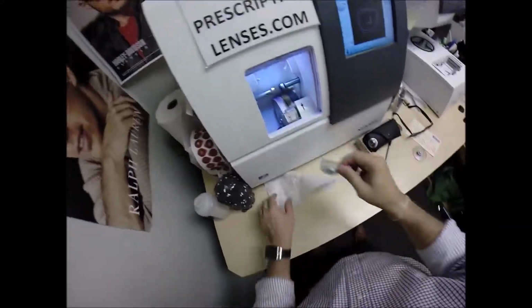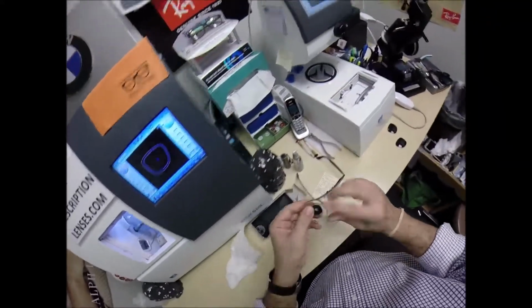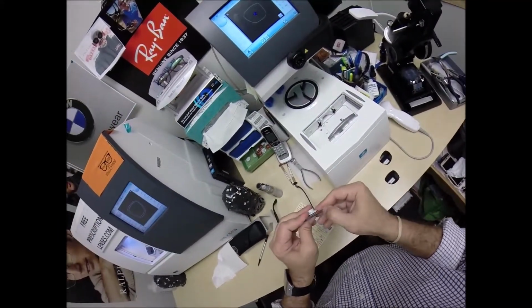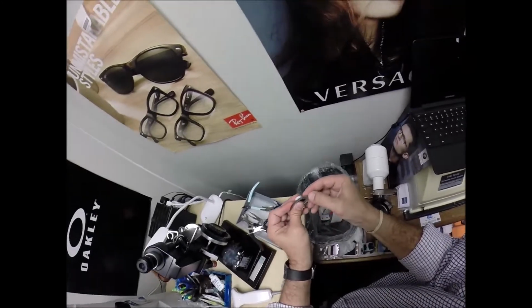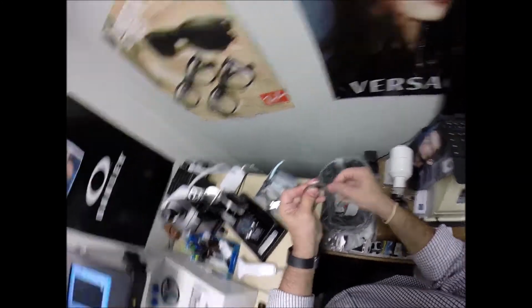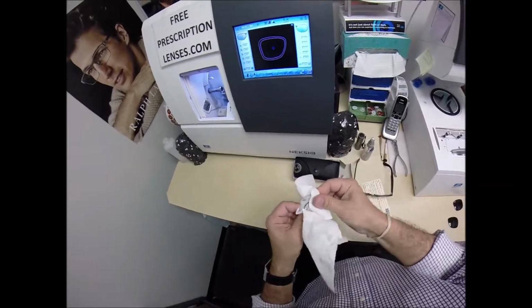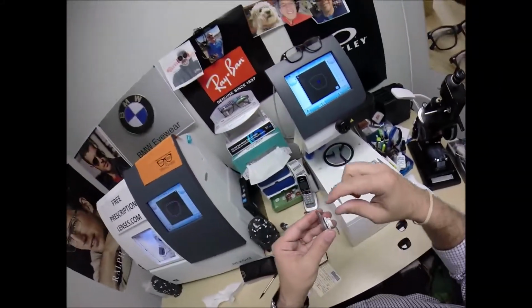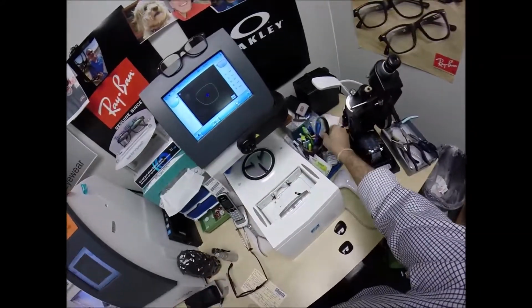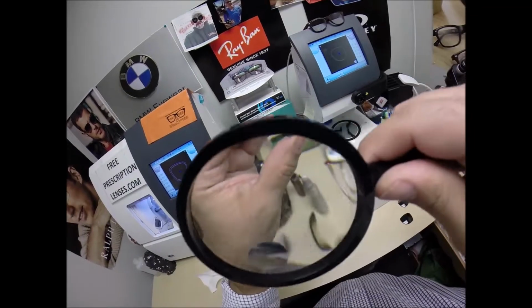Take the lens out, dry everything off, run my thumbnail around to get any optical sawdust, also known as schwarf, off the edge of the lens. We're going to drop that into the trash can. Again, dry everything off so it's not slippery. Now what you can't see is I move the bevel to the front of the lens, which is going to force the lens to sit towards the back of the frame.